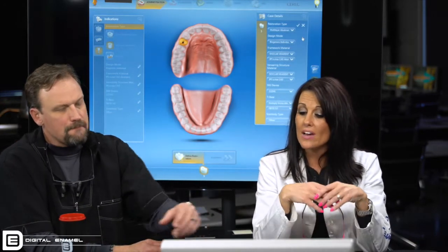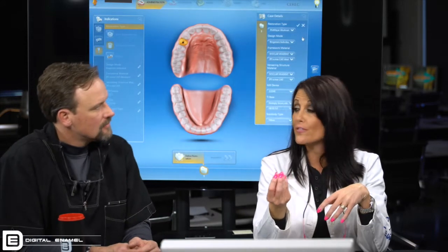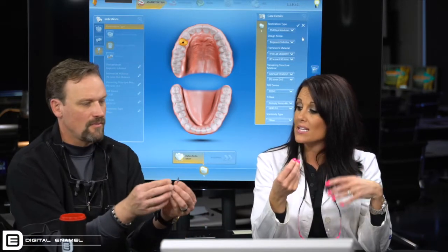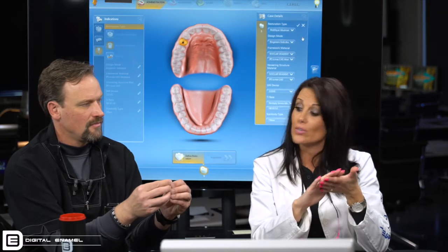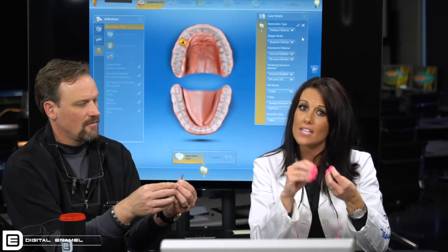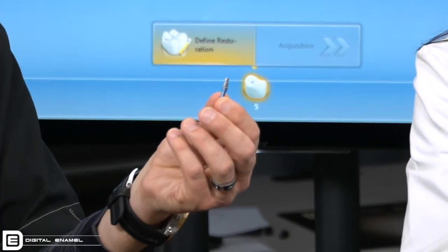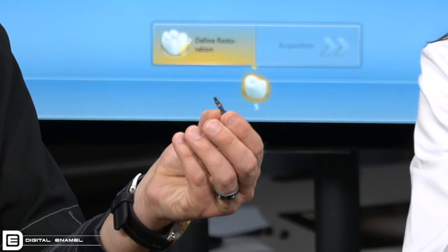We also have the analog for all of those sizes. When your scan post comes out of the sterilizer, we sandblast it because it's a very shiny metal — the Omnicam has a tough time seeing things that are really, really shiny. So we sandblast the outer surface to give it a matte finish so it scans in better and we don't have a lot of problems. But what happens is you've now sandblasted off the size markings.